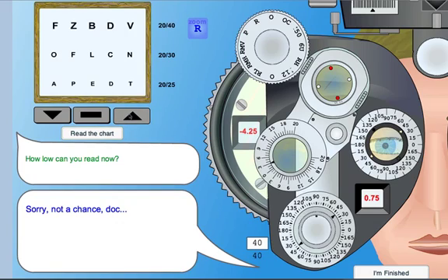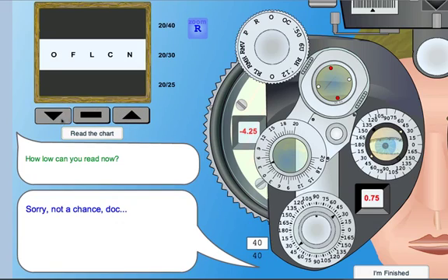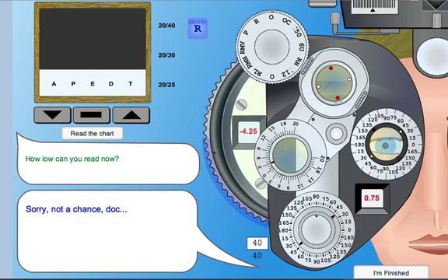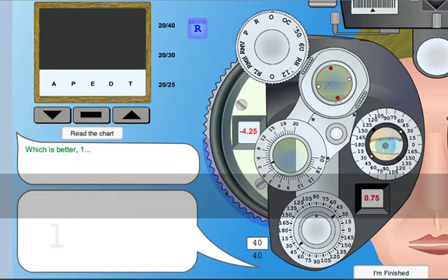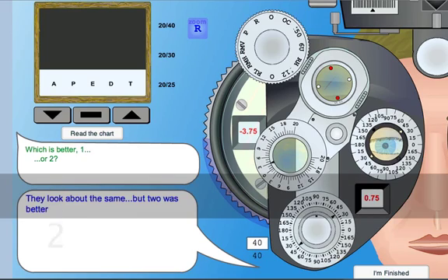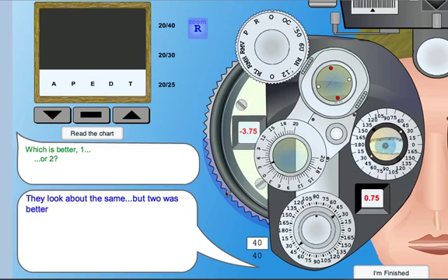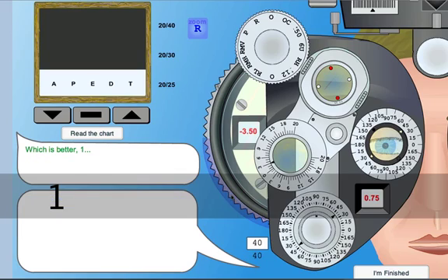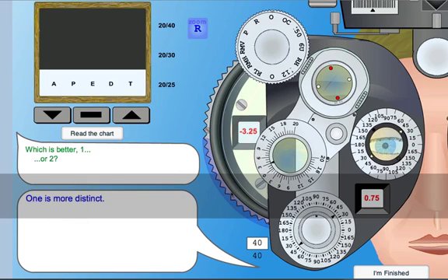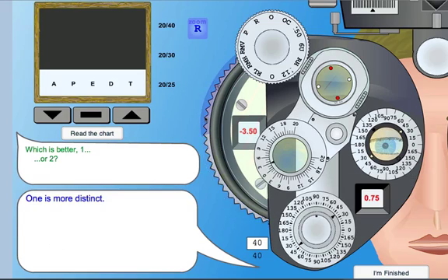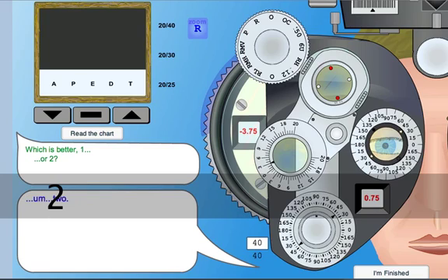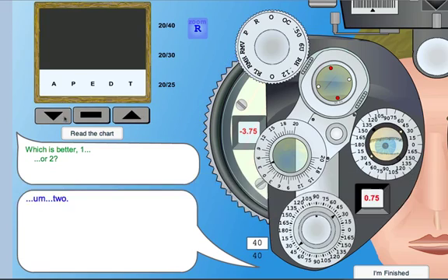Basically, we'll just isolate this row and ask which one's better, choice 1 or 2? And we get a response that a typical patient might give — something confusing: they look about the same, but 2 is better. How about now, 1 or 2? And they liked 1 better. How about here, 1 or 2? And there they like 2.